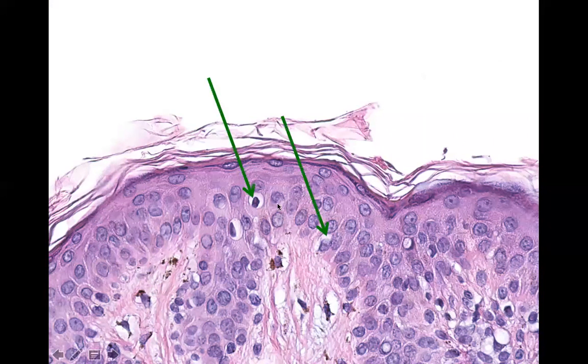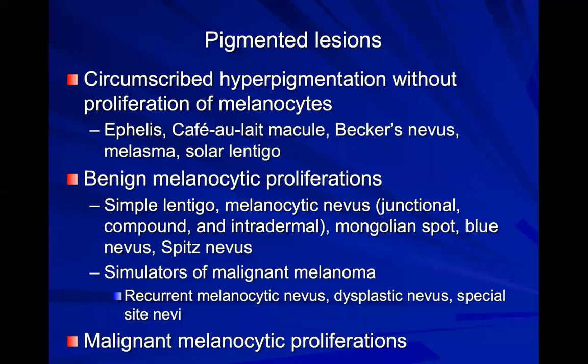In contrast, keratinocytes can have a halo also. So here you have a nucleus, and now you can see there's a halo around your nucleus, but your cytoplasm is still attached to your cell wall, which you can see here as your desmosome. So your cell wall and your cytoplasm is intact here, halo around the nucleus, here halo around the cytoplasm, which is being torn away from the cell wall. Okay, so not all white spots mean melanocytes.